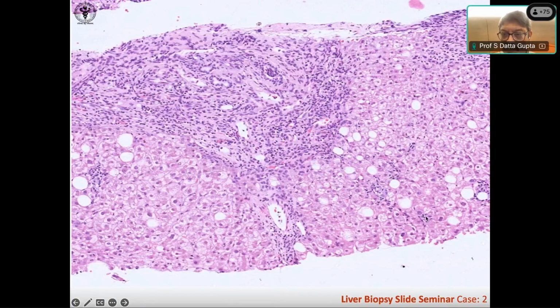You see, this is spotty necrosis. This is a small area of confluent necrosis. Not finding hepatocytes, but you're finding lymphocytes. And this is interface hepatitis, piecemeal necrosis. Here, see, the boundary is not good, but here the boundary has become irregular now, right? And this is a case of a small area of confluent necrosis. That's fat. This is all in the periportal area.